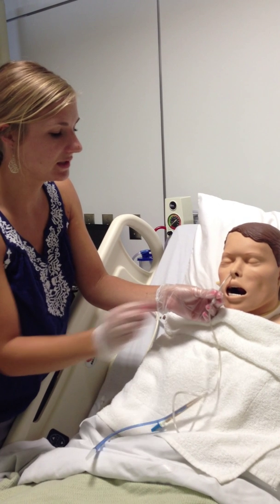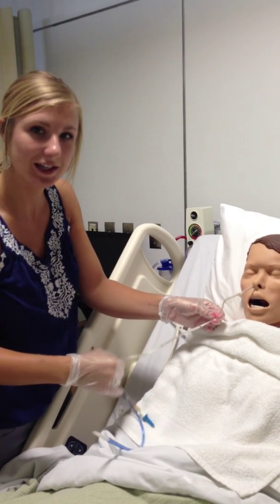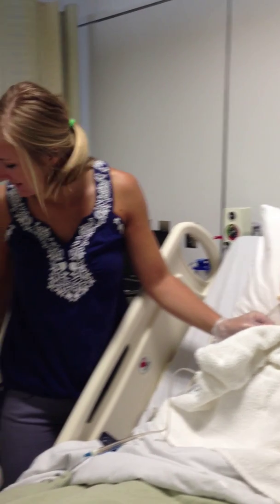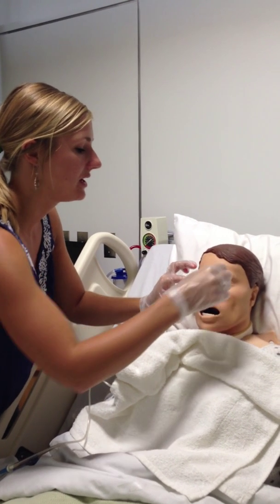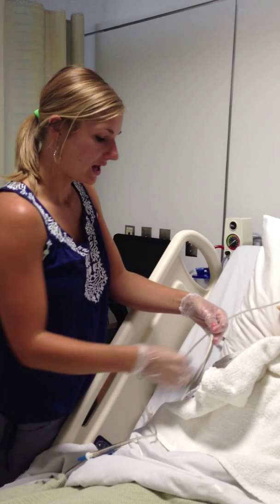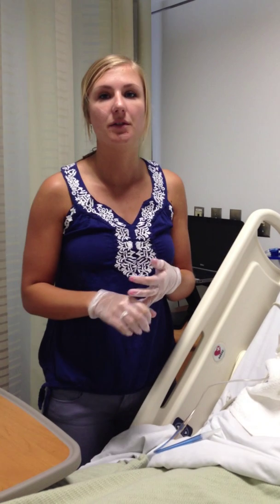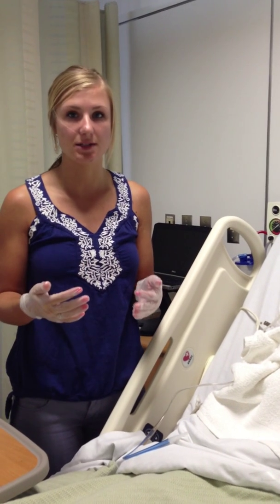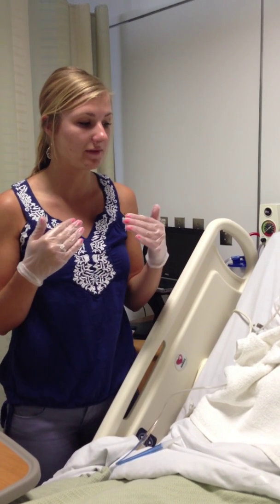Normally you would put it all the way in; sometimes mannequins have a little trouble — I've got a short little NG passageway. Once it's in the right position, I'm going to tape the tubing to the nose to hold the position. If at any time during the procedure the patient gags, coughs, or chokes, we can pull the tube out and reinsert it. We can also check the oropharynx to make sure the tube is not coiled in the back of the mouth, which could be why it's not inserting.